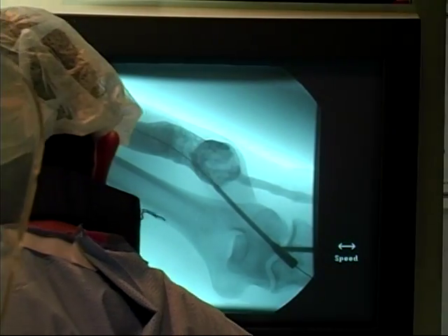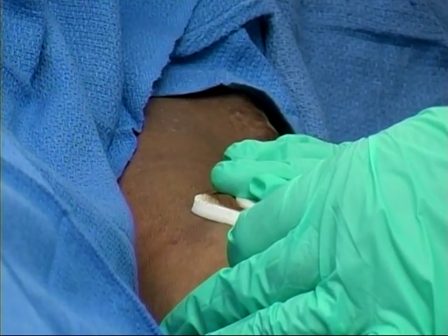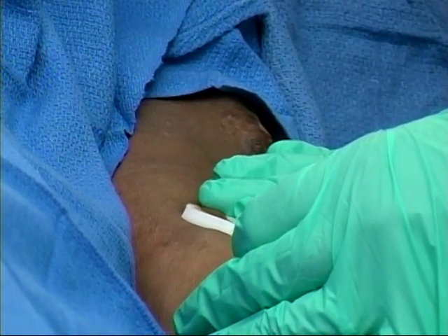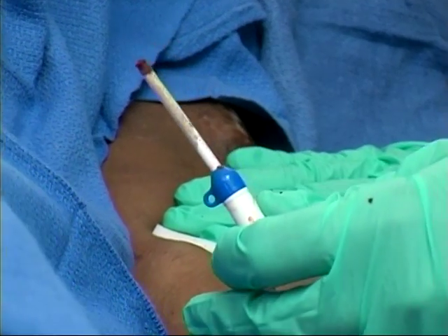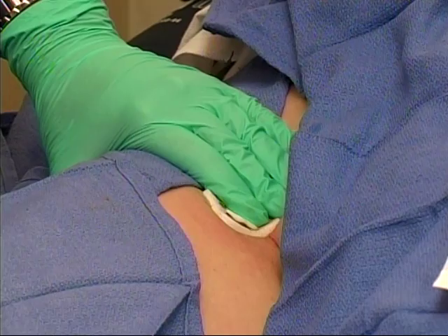BioSeal Advanced can be used as a manual pressure adjunct for many types of diagnostic or interventional procedures, and may also be used safely in conjunction with other closure device deployments that continue to ooze.